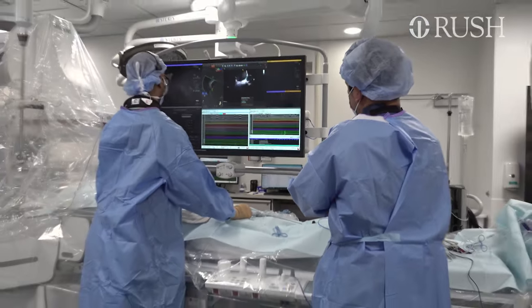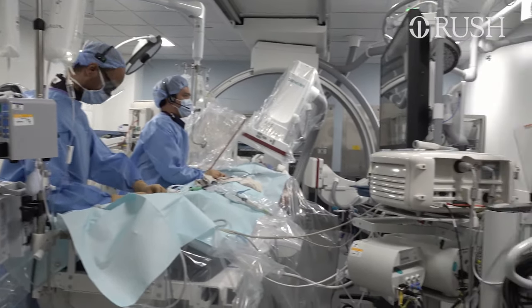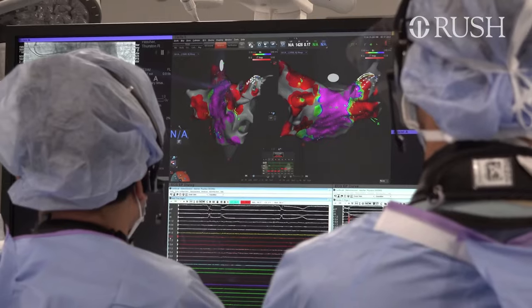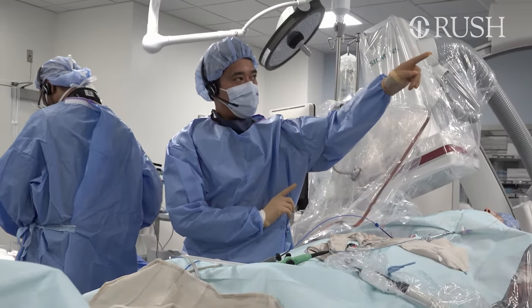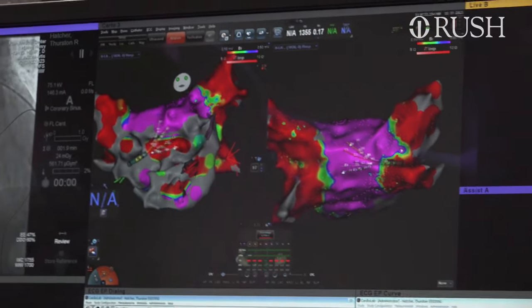So Mr. Hatcher had an ablation before. So now we're gonna check electrically to see if the ablation was effective. Often for a second ablation, the veins are reconnected. There's a small area, you see how it's a straight line on the left side, but on the right side, you see sort of a triangular chunk of healthy tissue. So we'll add some ablation there.